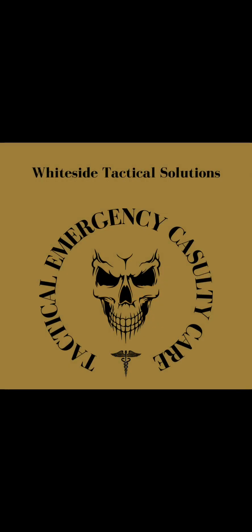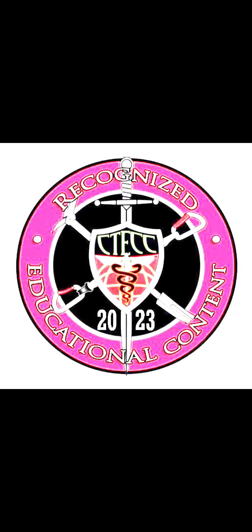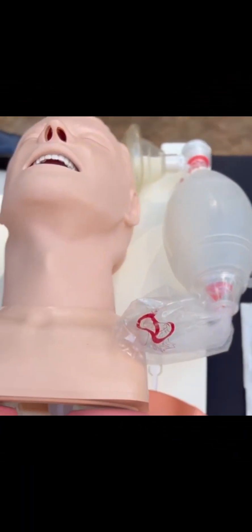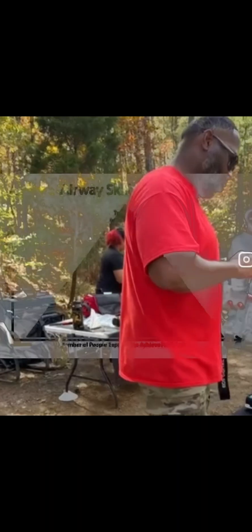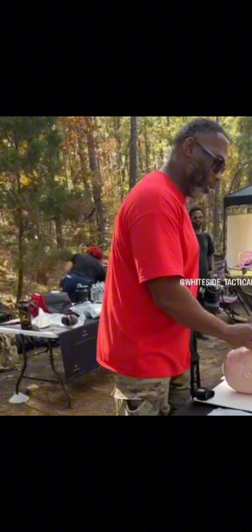This is Eric Whiteside with Whiteside Tactical Solutions. Here's a sneak peek of the Whiteside Tactical Solutions TECC event, led by Dr. Derek Whiteside, as he teaches participants about airway management. Watch as Dr. Whiteside explains and then demonstrates how to use the nasopharyngeal airway.